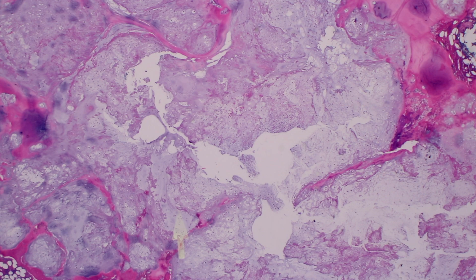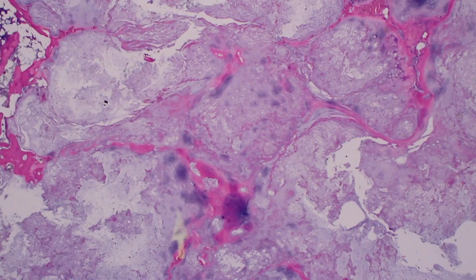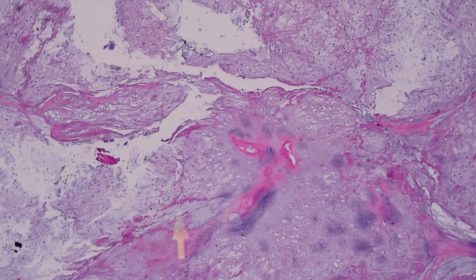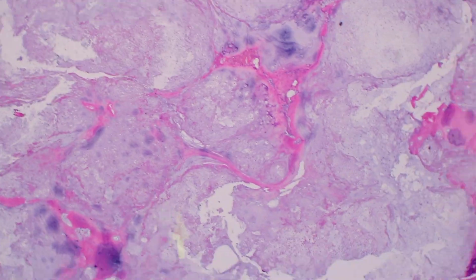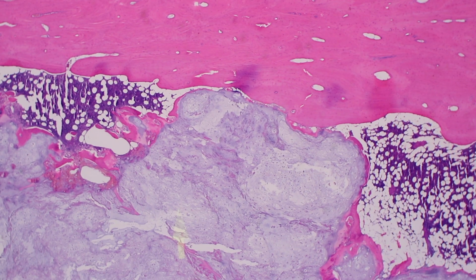So at low power, we have a mass-occupying lesion that is composed of hyaline cartilage. In assessing the biological potential of cartilage tumors, we rely on a variety of different histological features. One is its margin of growth.